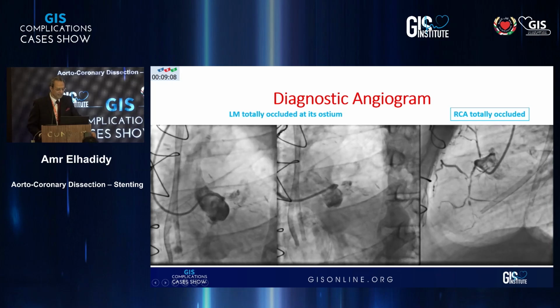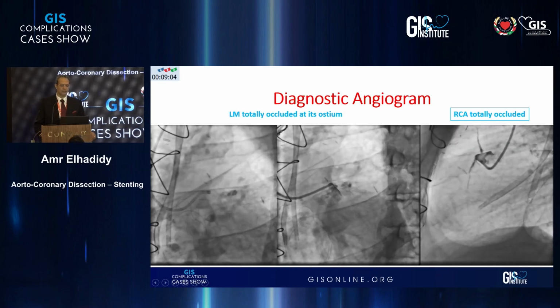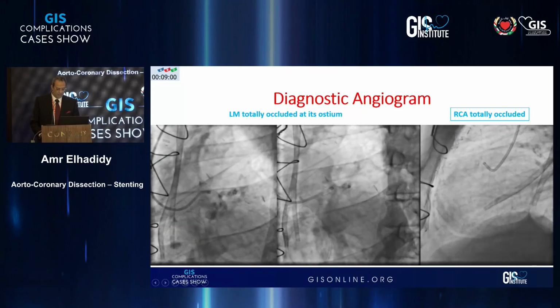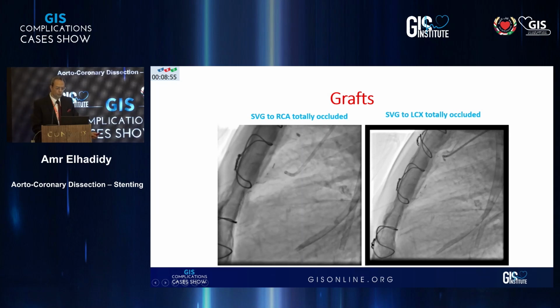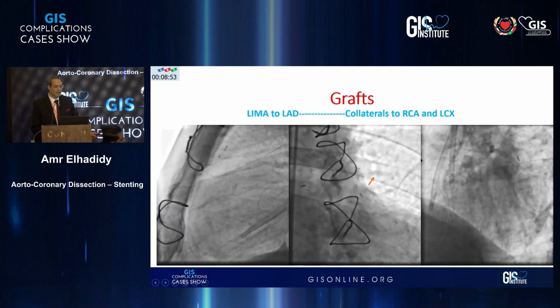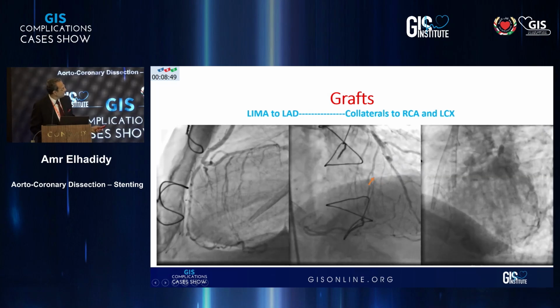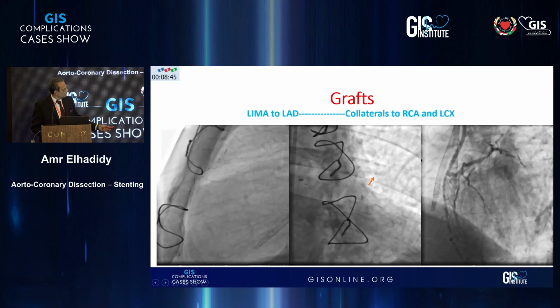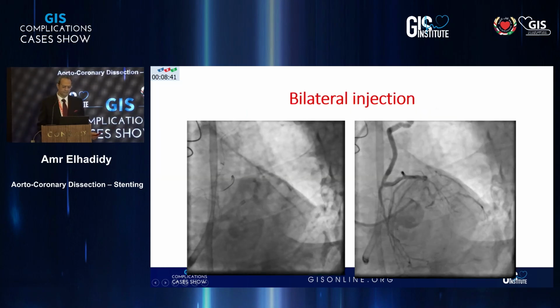And this is the diagnostic angiogram. You see, there is a totally occluded left main from the ostium. RCA is totally occluded. And if you look here for the vein grafts, all are occluded. And the LIMA to the LAD, you have good collaterals, this is the LIMA, connection very good. And there are some collaterals giving retrograde flow through the LCX and distal RCA.